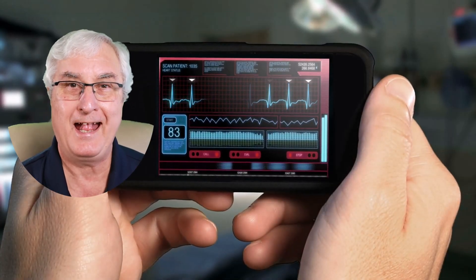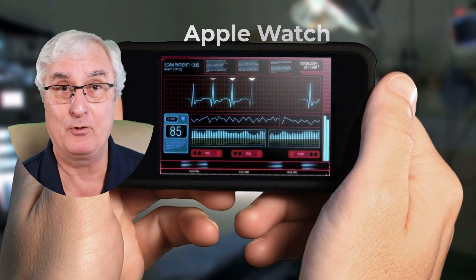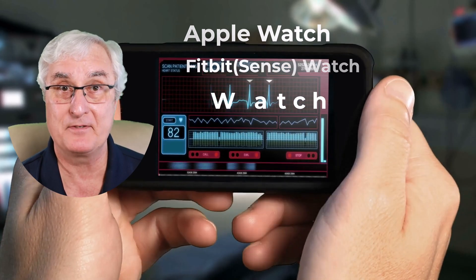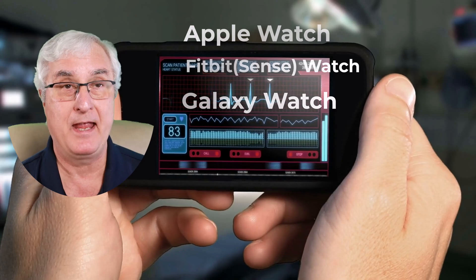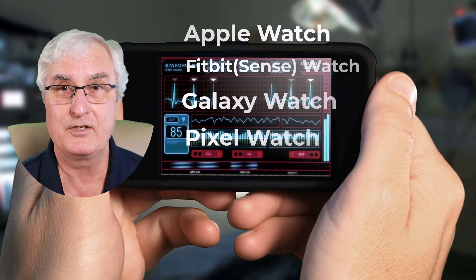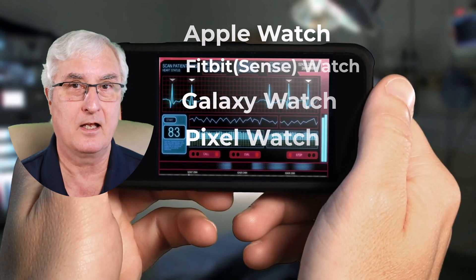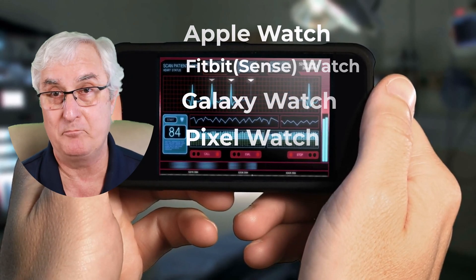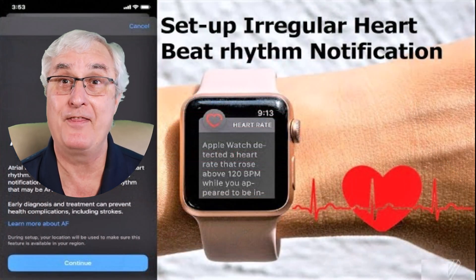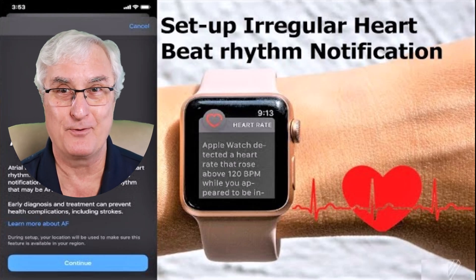The four watches with the FDA-approved ECG feature are the Apple Watch, the Fitbit watch, the Galaxy watch series from Samsung starting from the Galaxy 4 and up, and Google's new Pixel watch. Please don't buy watches from cheap imports — it's not worth your health. Part of the large Fitbit and Apple studies covered not just the ECG app but the next feature that came out: irregular heart rate notification.